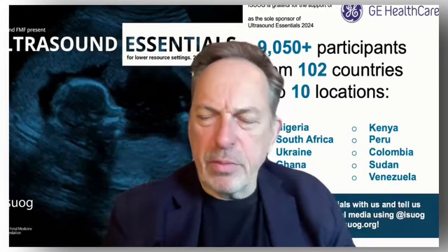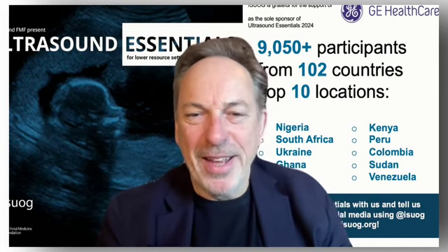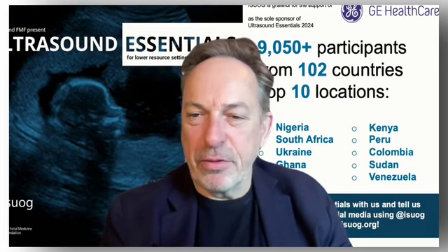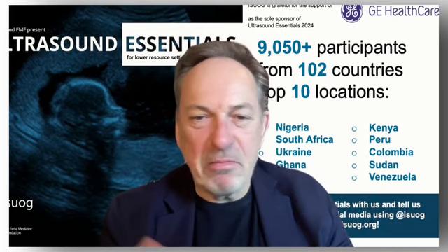I think one of the problems people have in practice, and I certainly know in London, is that if you start doing that, people say you're rubbish at scanning and go off down the road and see someone else. So what do you think, for example, in a postmenopausal woman, roughly speaking, what percentage of women is unmeasurable: 10%, 5%, one? What's your feeling? I think 10%. Yeah, I agree.